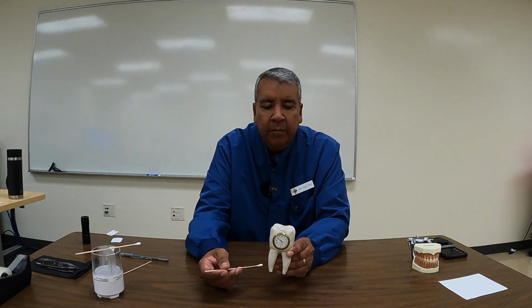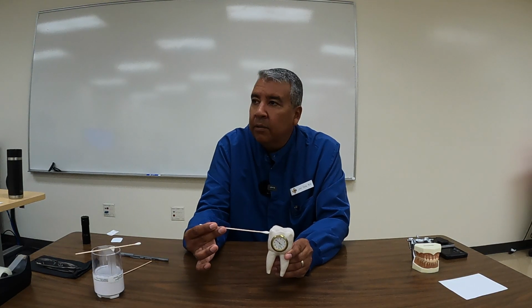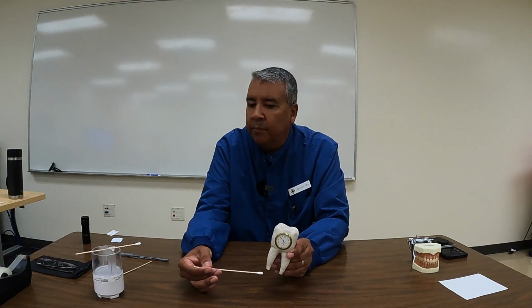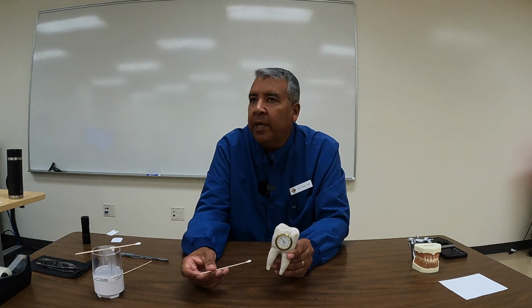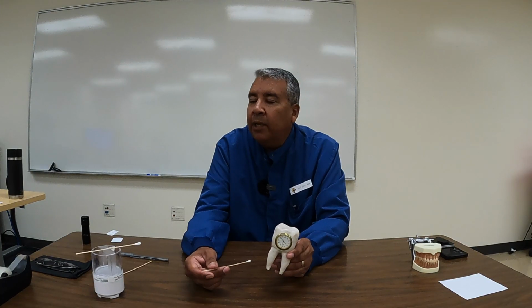So whenever you take a periapical film, you should be seeing the crown, the root, the apex, and the surrounding bone structure of at least 3 to 5 millimeters beyond that apex. So the area around the apex. A doctor may ask you to take a periapical, or he may say, can you just take a PA of a particular tooth? And then you have to say, okay.